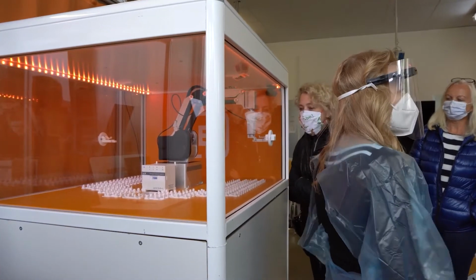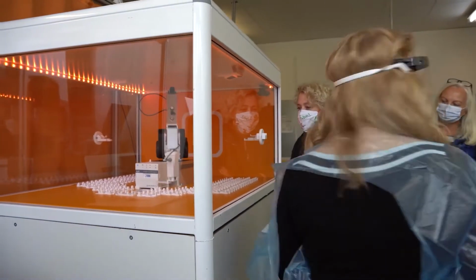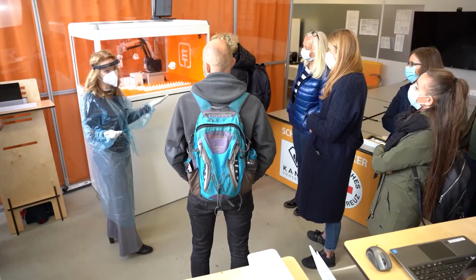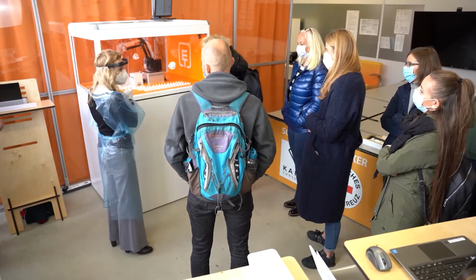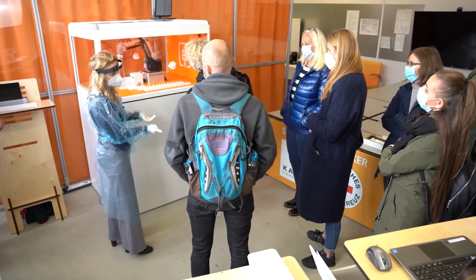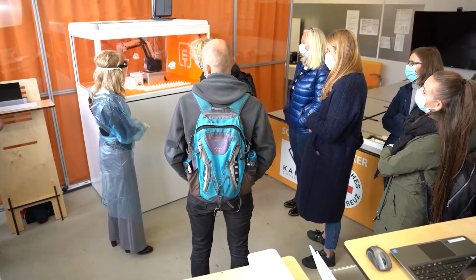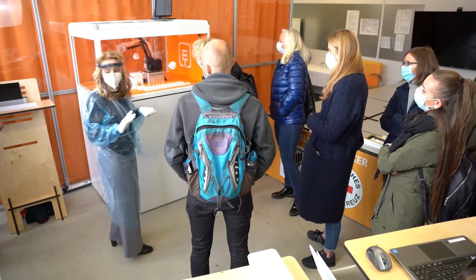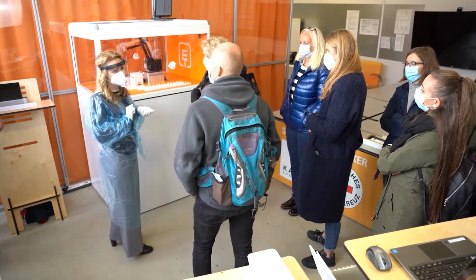I have nothing more to do. Now the droid is doing the job, and the computer and the cloud. So we will wait now 15 minutes because it has to be developed. It will take it, it will read it, and it will send the certificate directly to his email address on his hand.